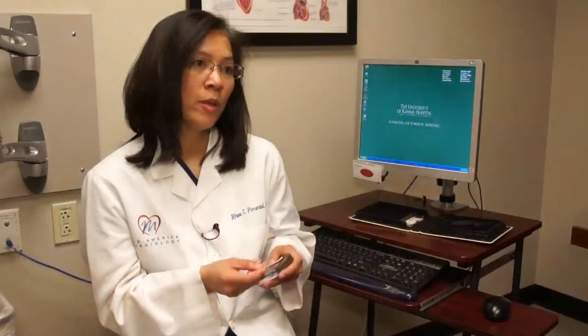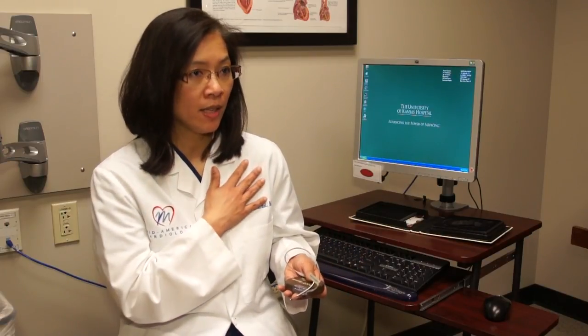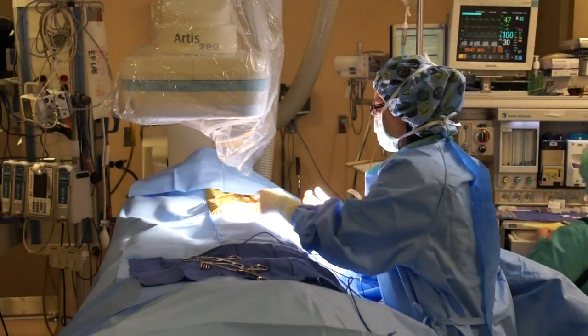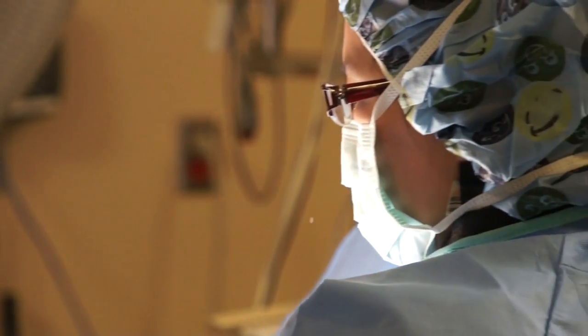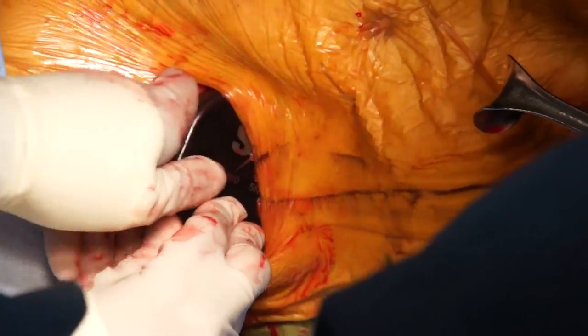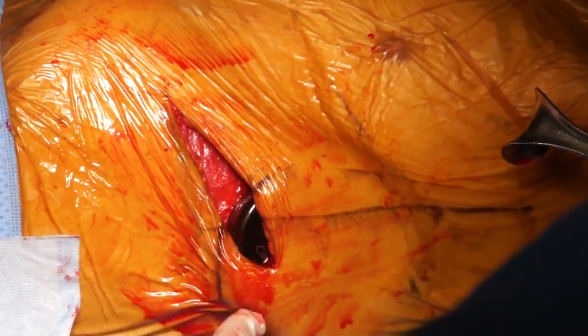This becomes a big issue in some of our patients that require their veins for things like dialysis, or if they have a port, or if they're getting treatment for some chronic diseases. A lot of times those areas will already be taken up, and we don't want to add to it by putting a wire in there for the defibrillator. The biggest benefit is that it offers us an option of putting in a life-saving device that is easy to take out and easier to put in, with less complications and less chance of infection.